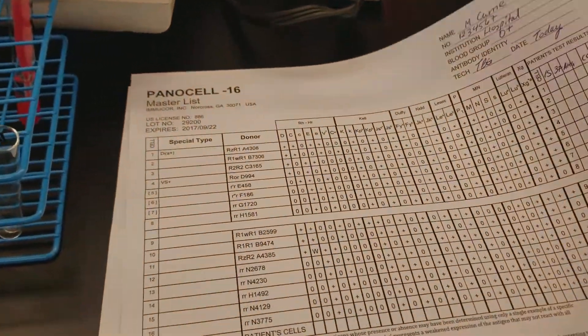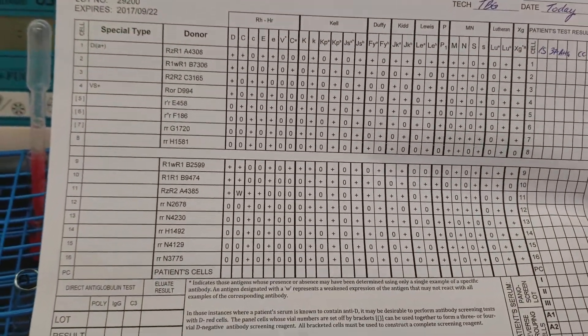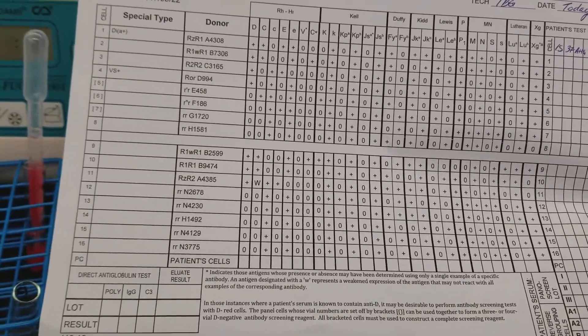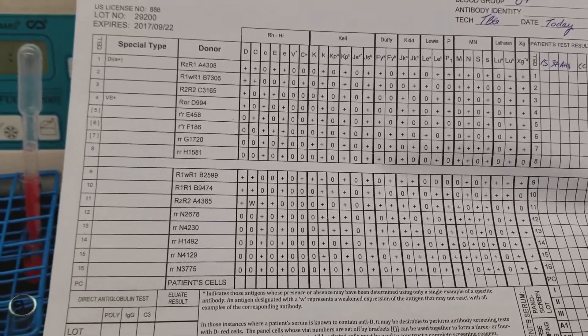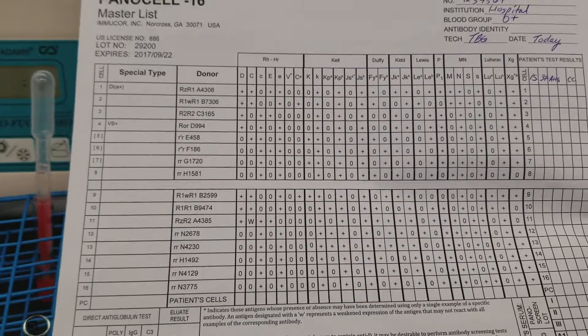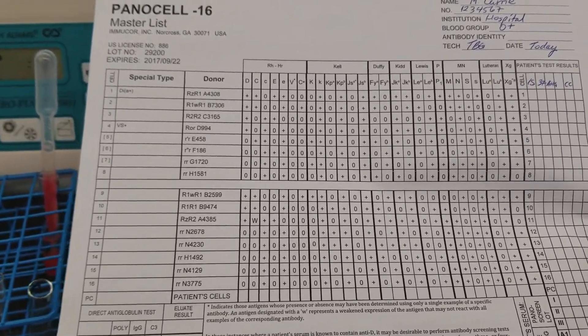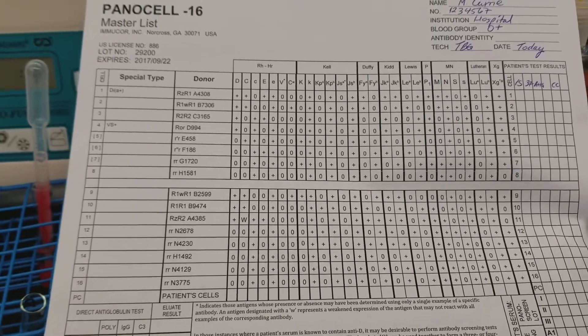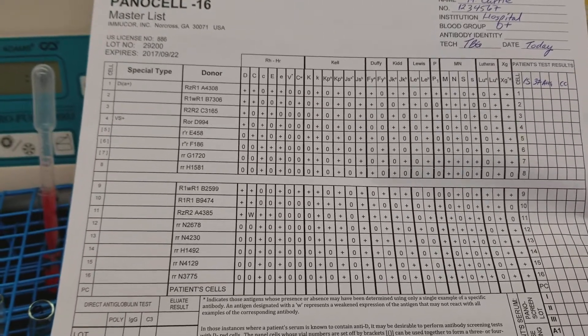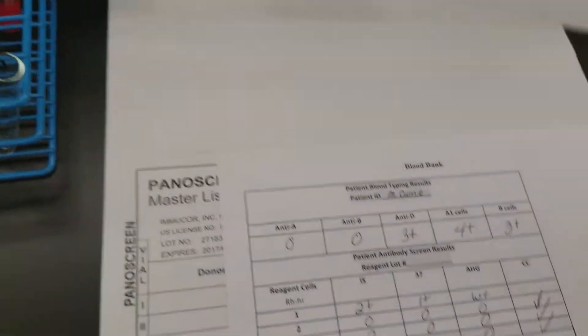We're back and we are doing an antibody identification panel. Usually we get a 10 cell panel but we've got a 16 cell panel, so this is going to be totally crazy because I'm going to have to use two centrifuges to do this all quickly. I'm going to try to make this not very long of a video because the explanations for a lot of this stuff you can find in the antibody screen video.